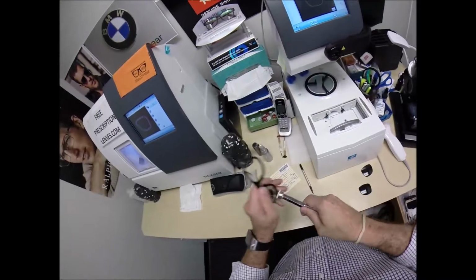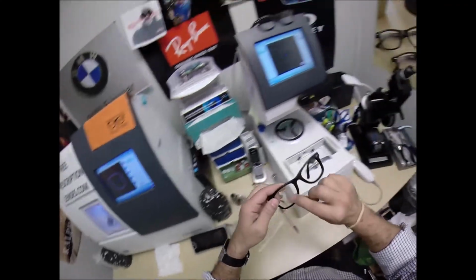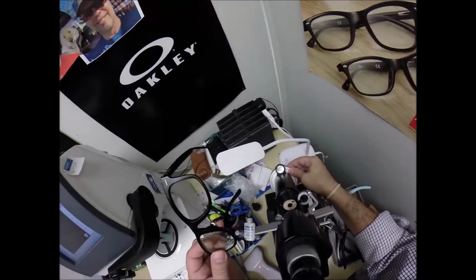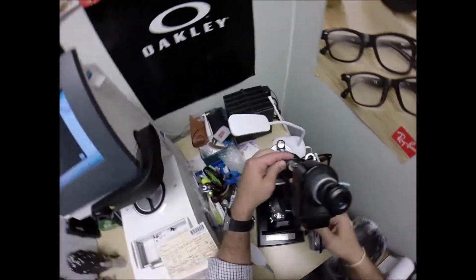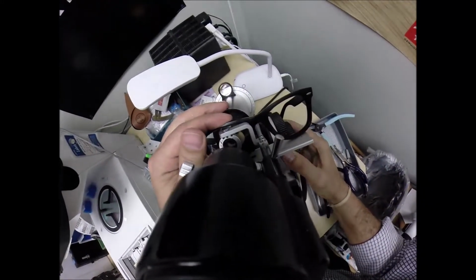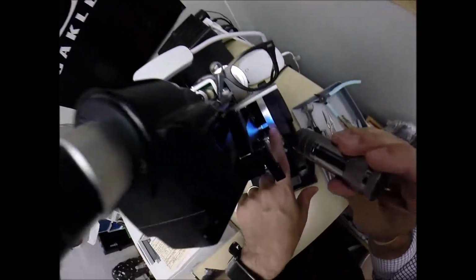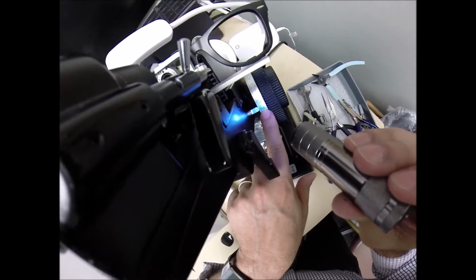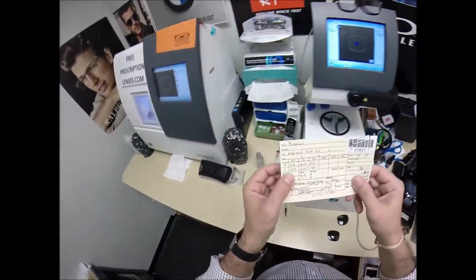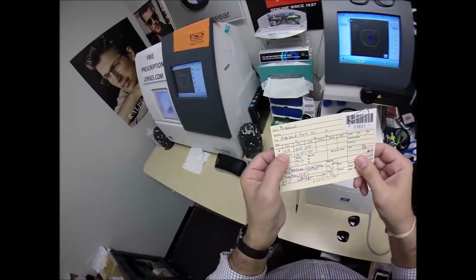We can go ahead and take the block off, dry that off, throw that back in there, pull the sticker away, put it in just above that black dot, which is your pupillary distance. We're going to spin that back to 10. Place it in over that black dot. And I am getting minus 275 going away from 2 heading towards 3. We're 1 tick mark away from 3. That is because your right eye is 2.75 diopters of minus power.